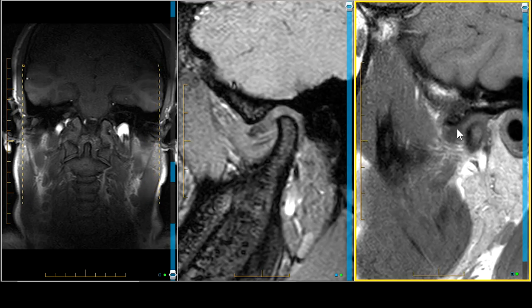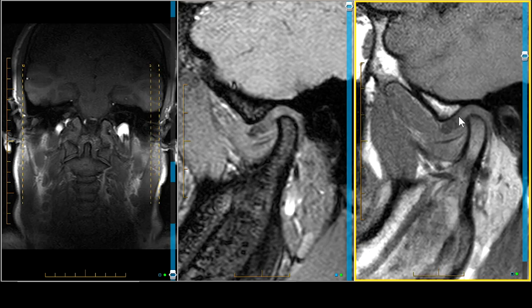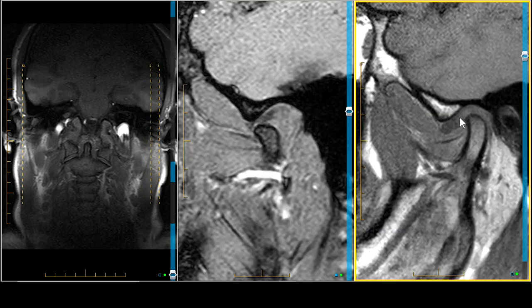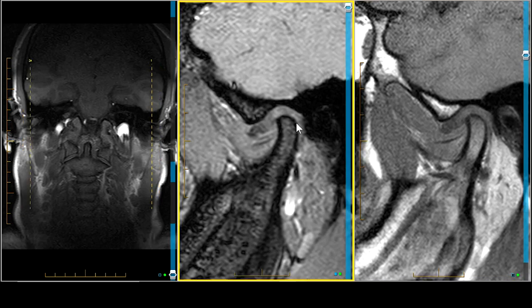Going all the way to the outside, there's still a little bit of meniscal tissue, so the anterior band is a little laterally displaced — we're seeing it a little too far out. Now we go to the middle of the meniscus and we're still having trouble locating a good quality flared posterior band. This is not the sequence you would use to look at the attachments; that's especially the open mouth view.